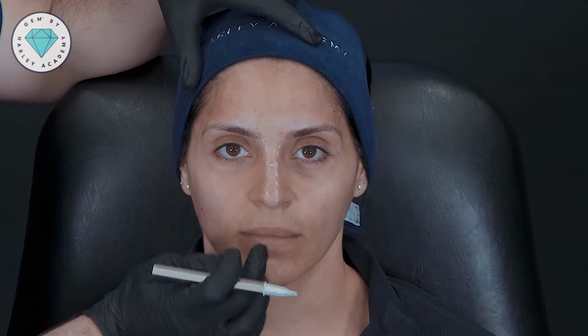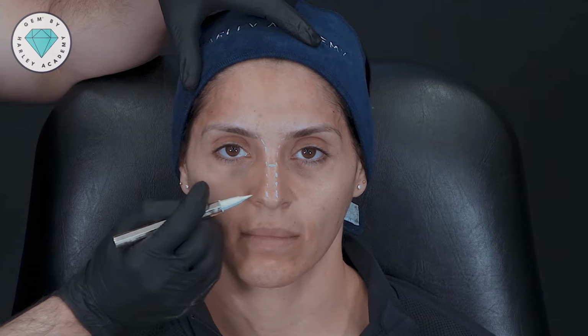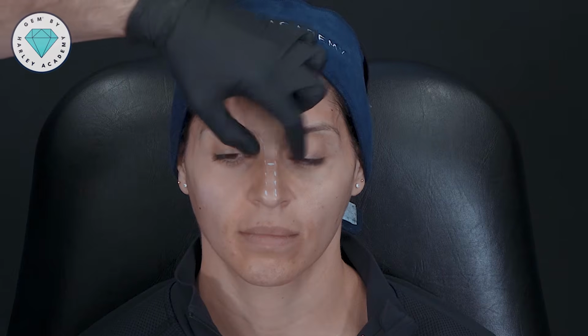I don't want to do anything to the tip. I'm going to use Botox to reduce movements in the tip and the alar of the nose, the lateral cartilages of the nose. So my focus is actually the midline of the nose. I'm going to use a cannula to achieve that.